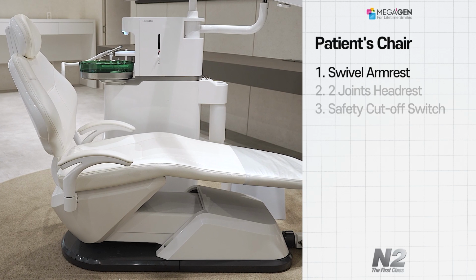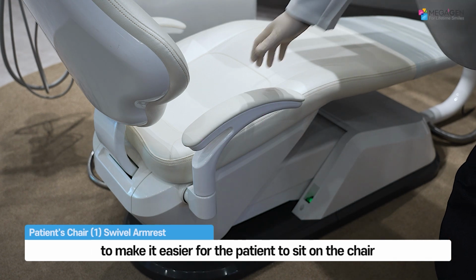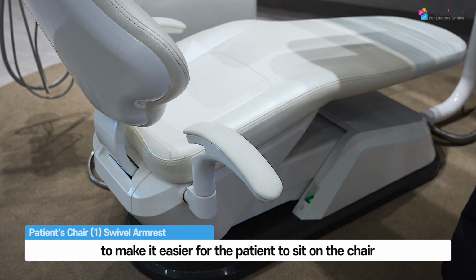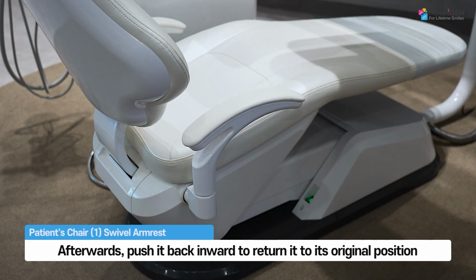How to adjust the chair armrest. The right armrest of the chair can be rotated outward to make it easier for the patient to sit on the chair. Afterwards, push it back inward to return it to its original position.